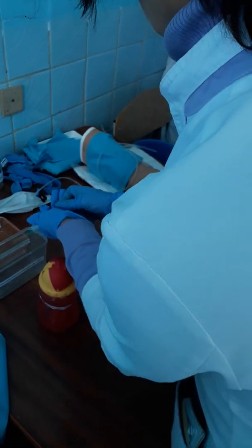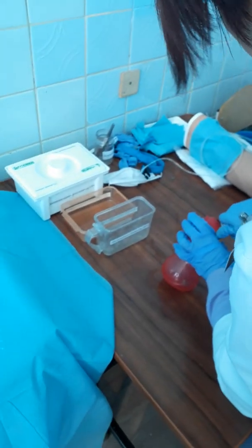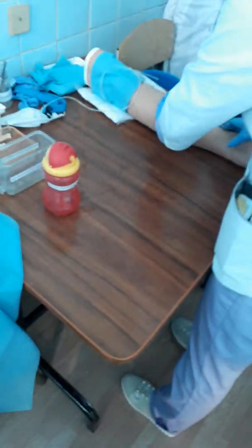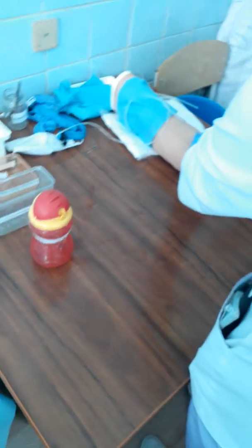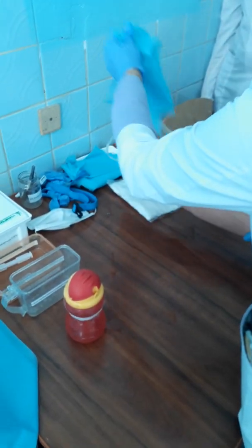After that you do disinfection, remove the needle without touching, separate, utilize. After 3 or 5 minutes you again control this part. Please show me your upper arm again. If you see the bleeding has stopped, you remove the tube, swab, tube and napkins.